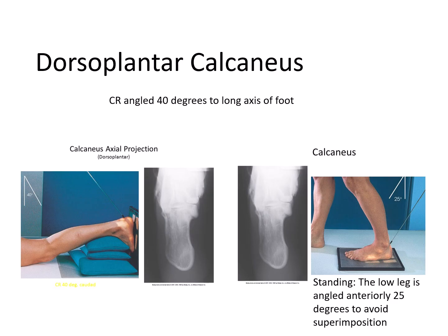These are two images demonstrating the dorsoplantar projection of the calcaneus. Whether you do plantodorsal or dorsoplantar, you still want the same exact x-ray. You're not going to do both of these. You'll do one or the other. When you do the routine, you'll only be doing two x-rays: one axial and one lateral. But these are just two other ways that we can do it.